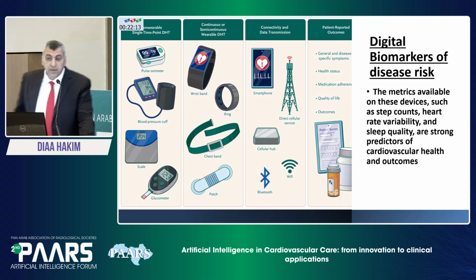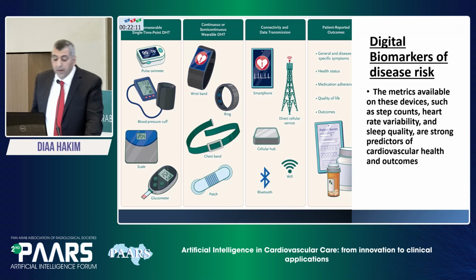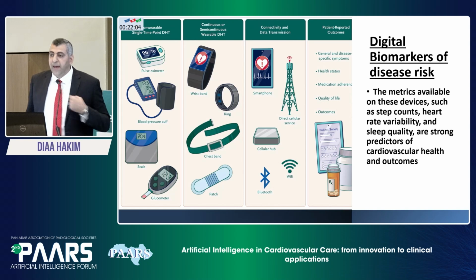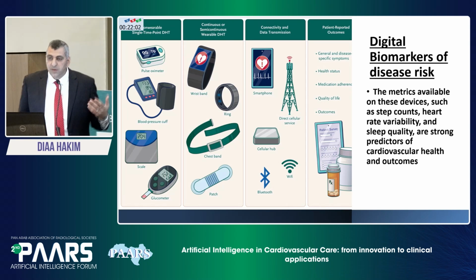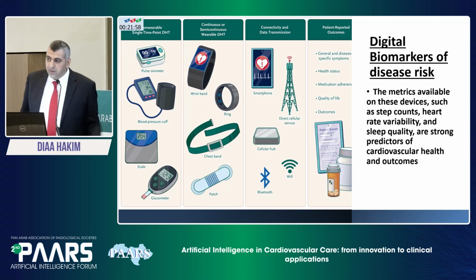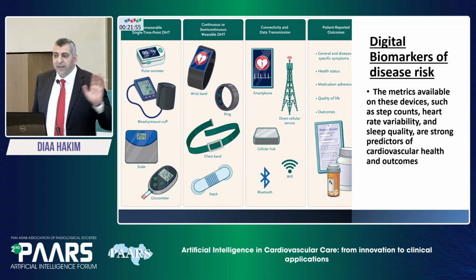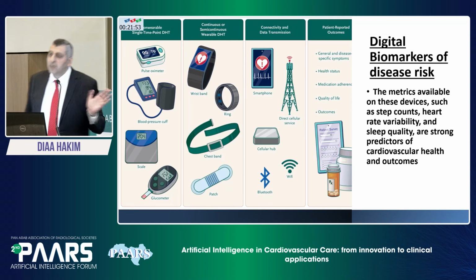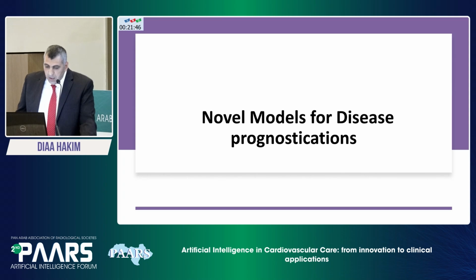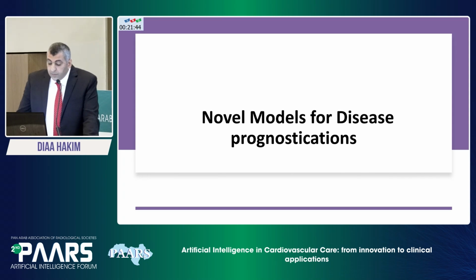And as you can see, that includes the wearable watches, the monitoring devices for heart rate variability, for blood pressures. We have some patches. We are using them to monitor even the ICD, the implantable cardioverter defibrillator. And thanks to the pandemic, that gave us some access to virtual monitoring of those patients. We have novel models of disease prognostication.